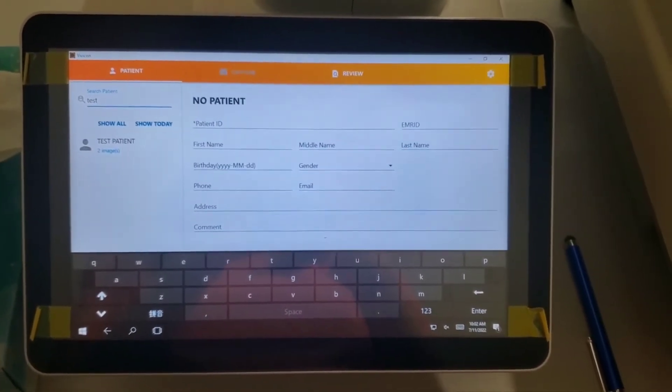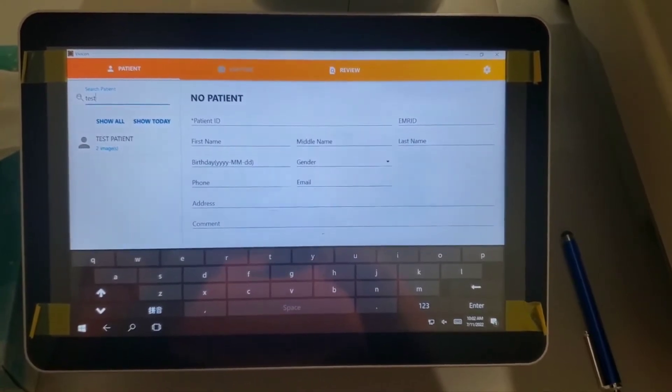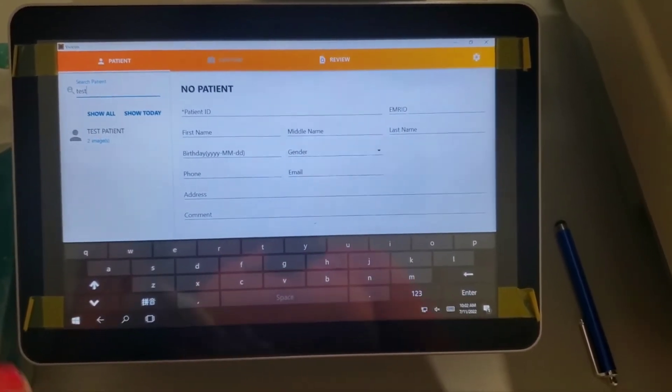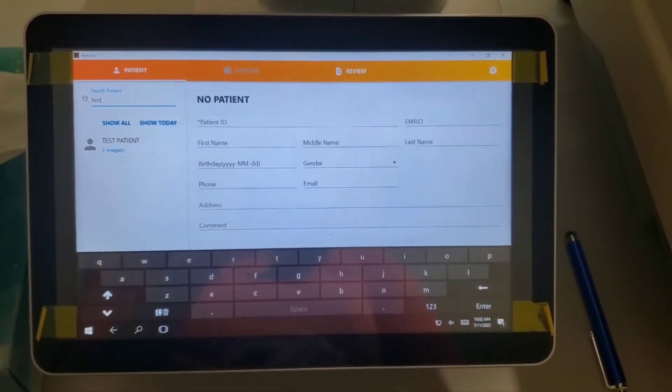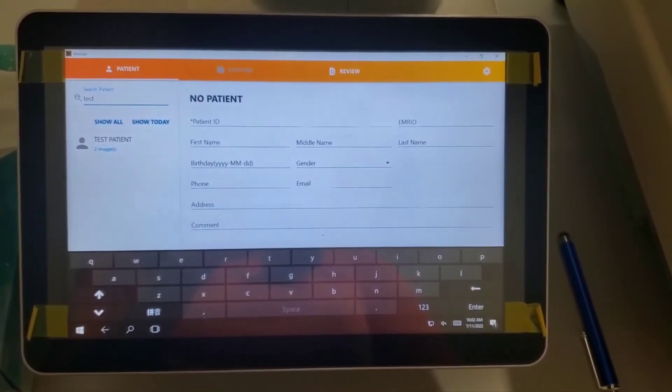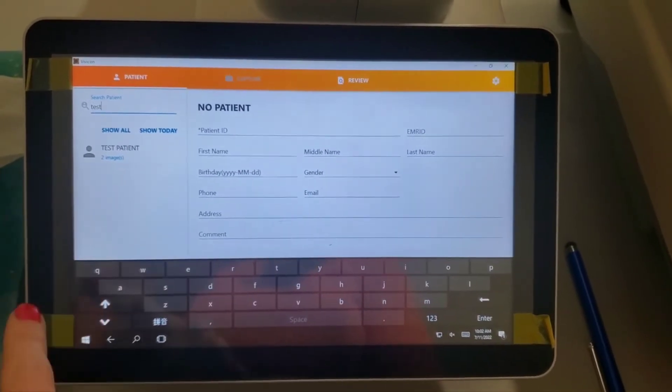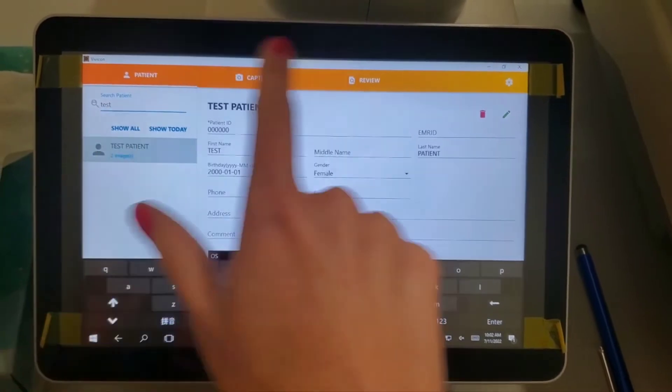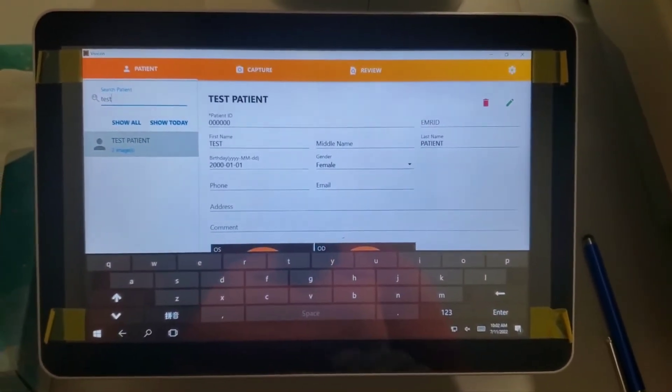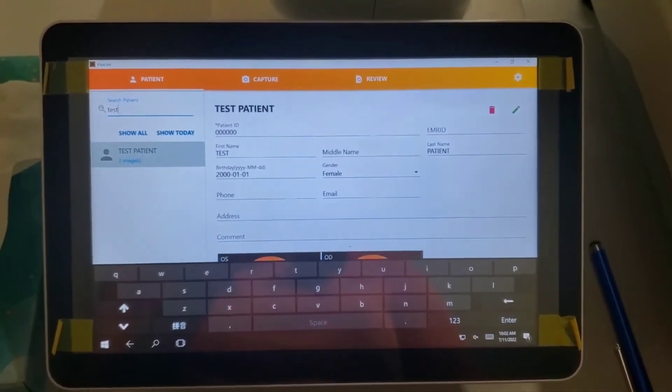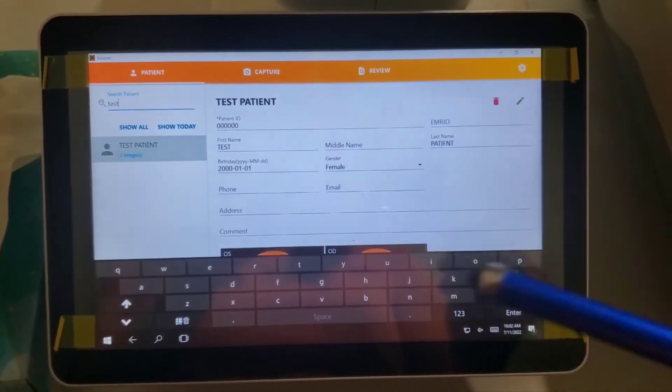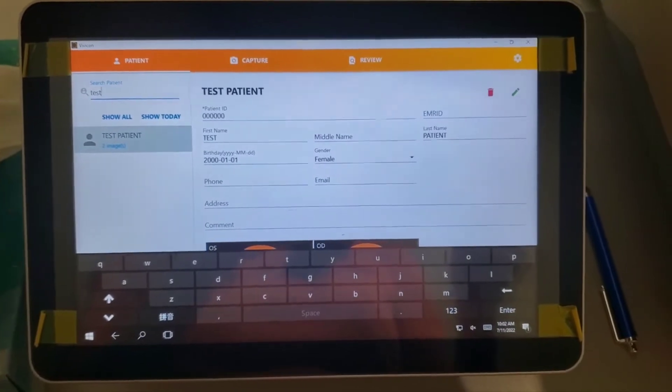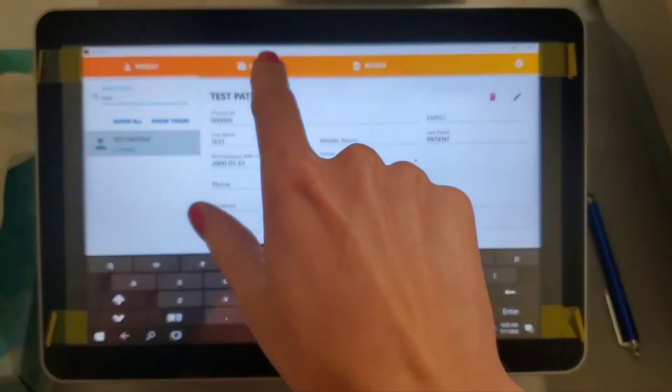If they are an established patient who has done this machine before, they should be in the database. Here under search patient, you're going to type in their last name. I'm going to use a test patient for today. If they are in the database, their name will pop up here and then you click it. This screen is touch screen. Sometimes it's really touchy. You have to sometimes hit the buttons multiple times. There is a stylus that we keep next to the machine if you'd rather use that. Once you have your patient's name pulled up, then you would hit capture.